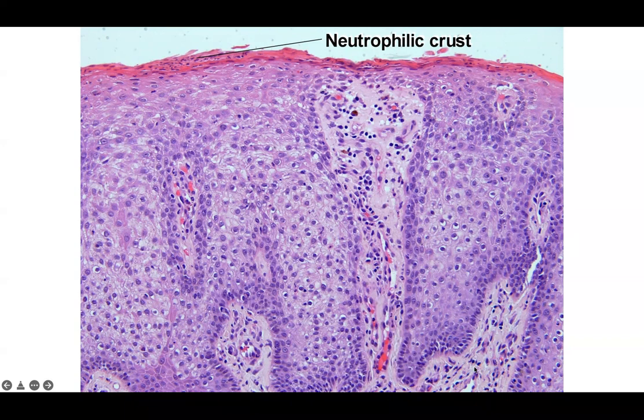And clinically, the scenario is going to be 100% different. But if you didn't have any clinical scenario, and I often find that these clear cells are just a lot more clear than what you see in psoriasis typically. But just to point out that it's interesting, it has a very similar appearance in many ways to psoriasiform hyperplasia.